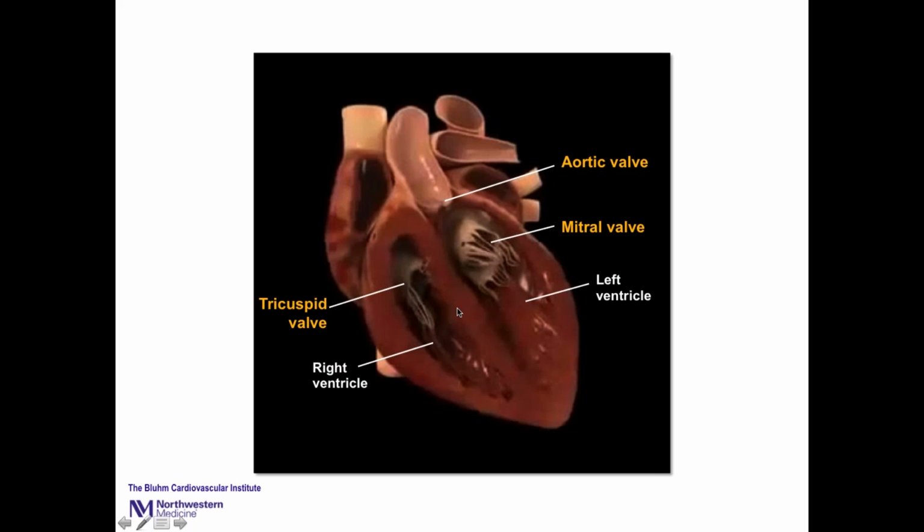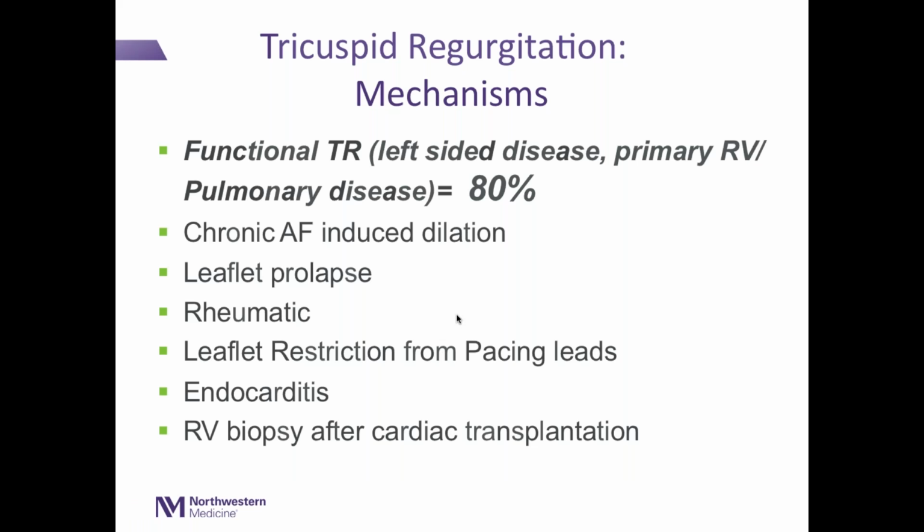The people that had previous mitral valve therapy, if the tricuspid was not addressed at that time, over time that valve may become diseased. So let's go to the next slide.